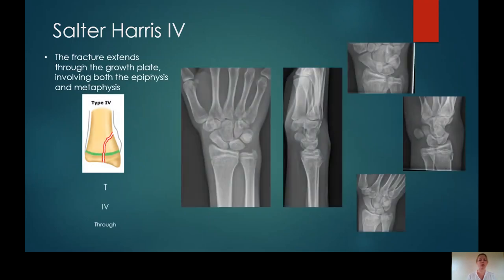Salter-Harris type 4 fracture extends all the way through from the metaphysis, through the physis, involving the epiphysis and into the articular surface. This is a scaphoid series. You can appreciate fractures on these images, and looking at it all together you realise the fracture is within the distal radial metaphysis. Looking closely at the DP and DP oblique projections, you can see a subtle fracture line extending through that epiphysis and into the articular surface. This patient also has an avulsion fracture of the ulnar styloid.